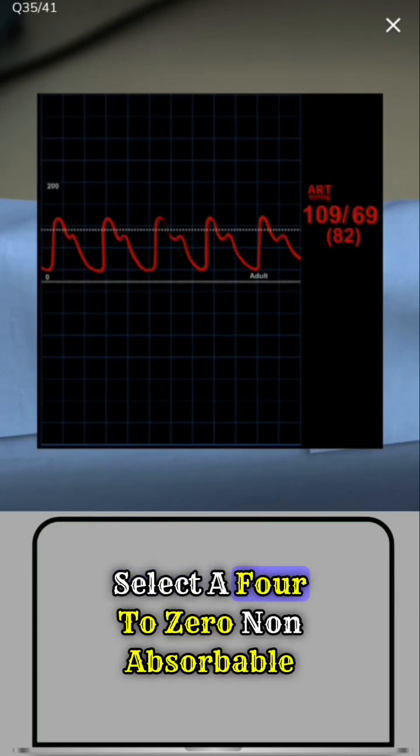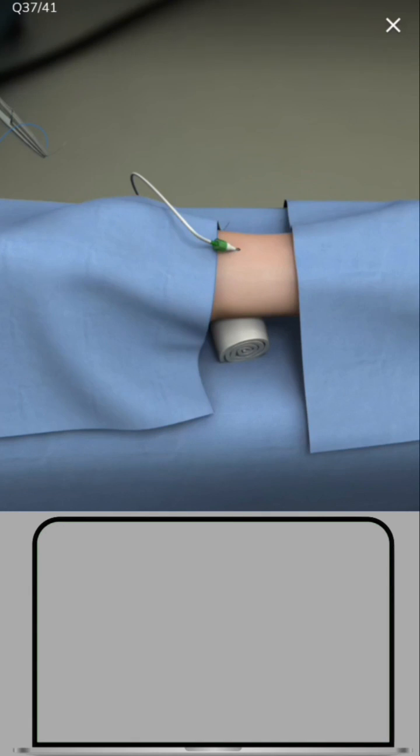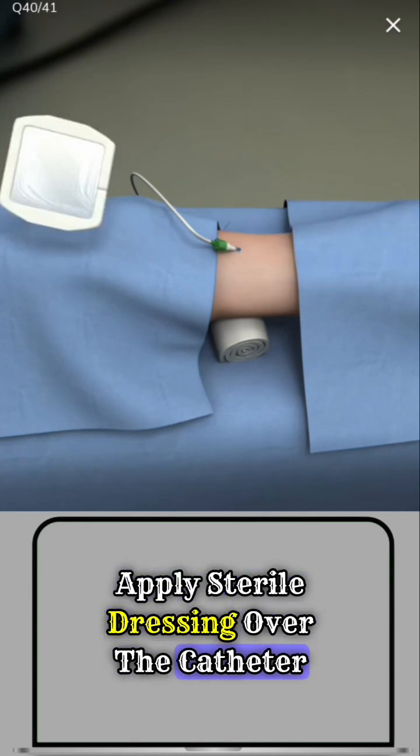Swipe to select a 4-0 non-absorbable suture. Secure the arterial catheter into position using sutures. Swipe to select a sterile dressing. Apply sterile dressing over the catheter site.